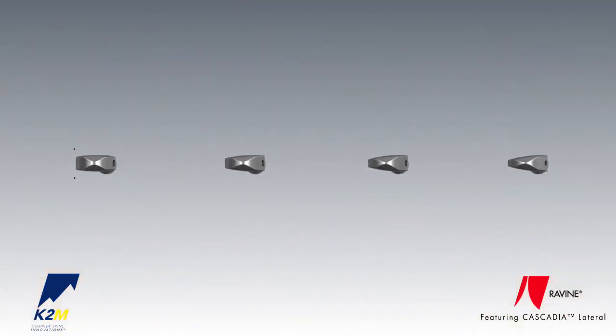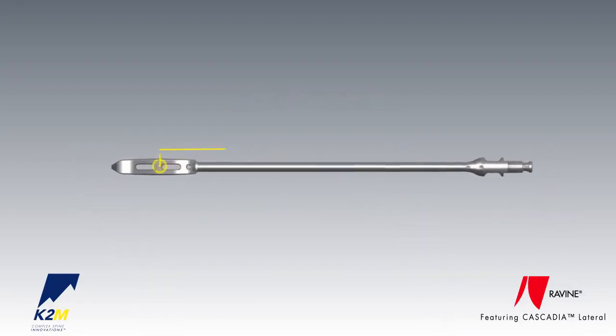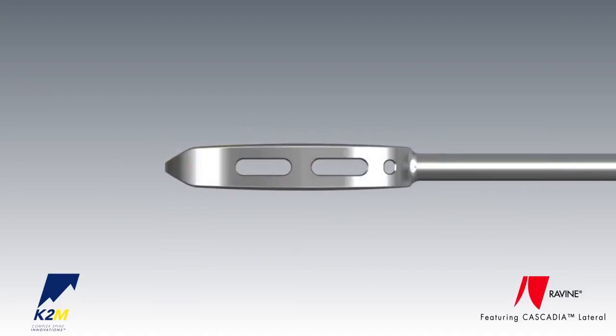Trials are available in parallel, 8, 12, and 15 degrees lordosis, and are 1 mm undersized in height to allow for a slight press fit of the implant. The 60 mm length trials are used to measure if a 45, 50, 55, or 60 mm Cascadia implant is needed. When looking at a true AP fluoroscopy image, the distance from the ipsilateral end of the trial body to the beginning of the bulleted tip measures 60 mm.